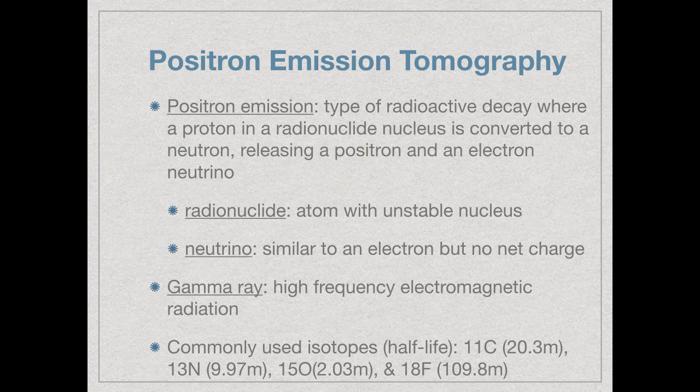It is absolutely essential that if you are going to use PET for any kind of imaging, you pair the correct radionuclide half-life of the isotope with your biodistribution. So if you choose carbon-11 and your blood half-life is 18 hours before your particle clears, your particle will be mostly in the blood when the half-life is already gone for the carbon-11.